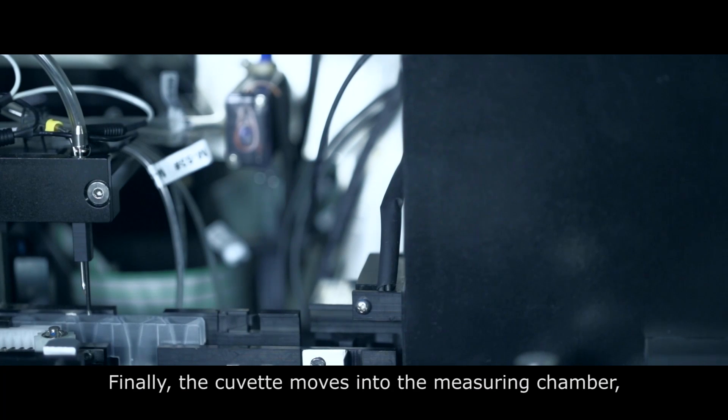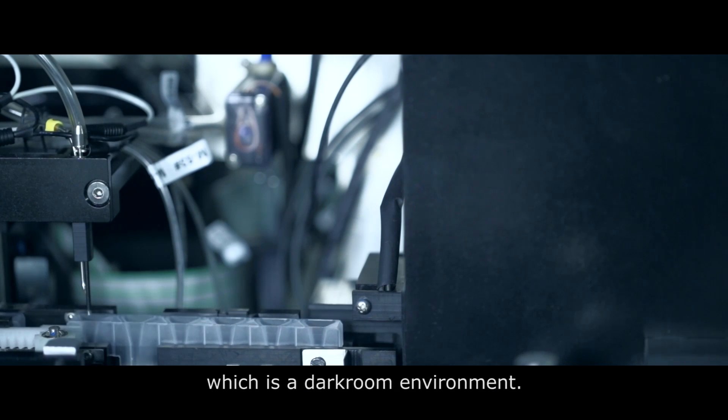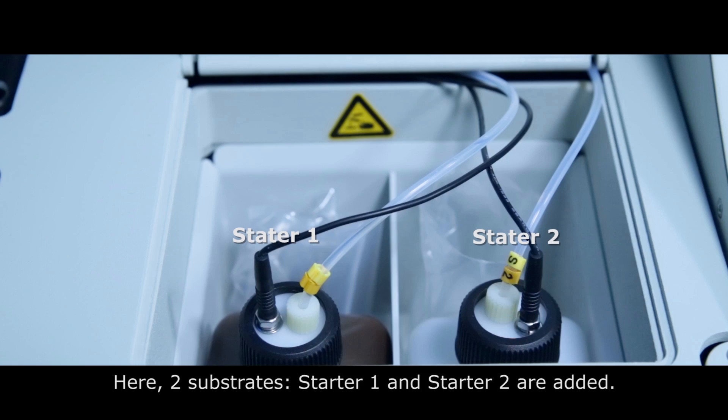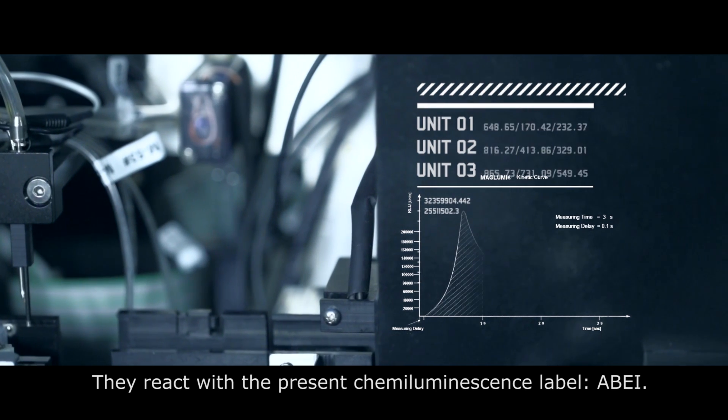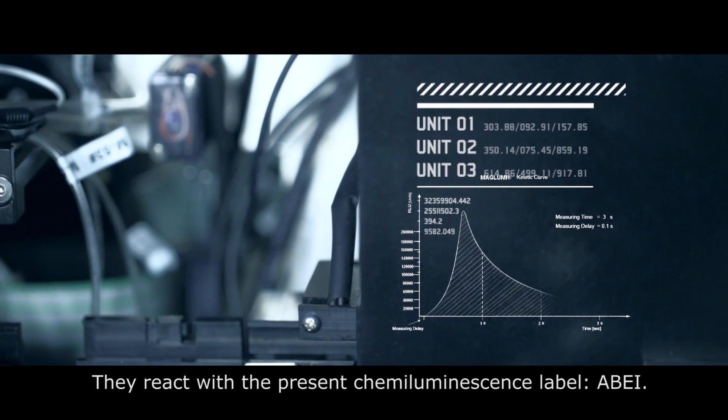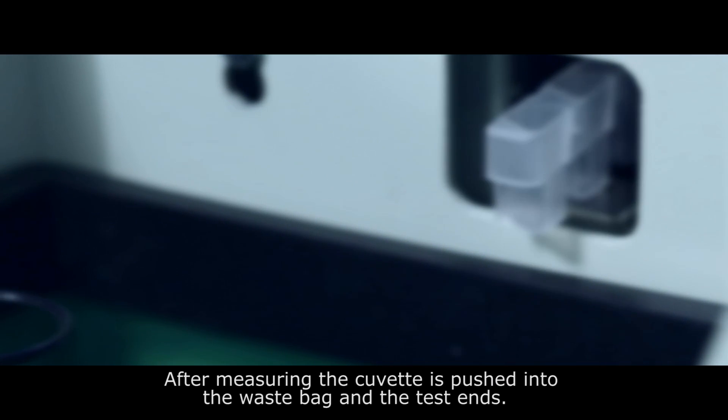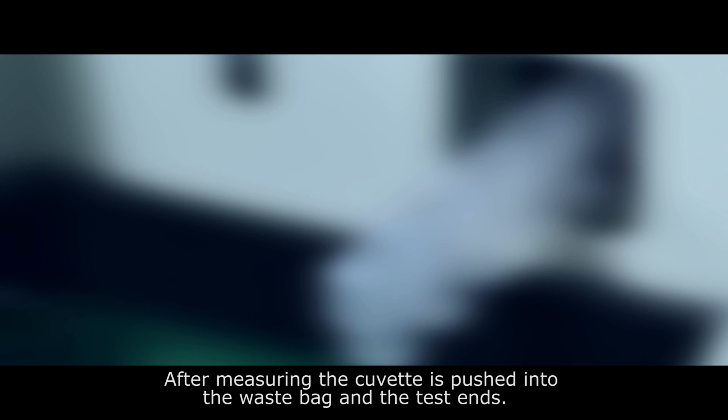Finally, the cuvette moves into the measuring chamber, which is a darkroom environment. Here, two substrates, starter 1 and starter 2, are added. They react with the present chemiluminescence label. After measuring, the cuvette is pushed into the waste bag and the test ends.